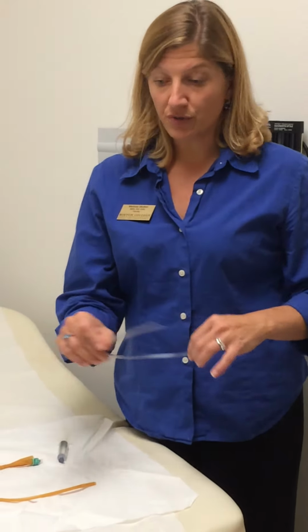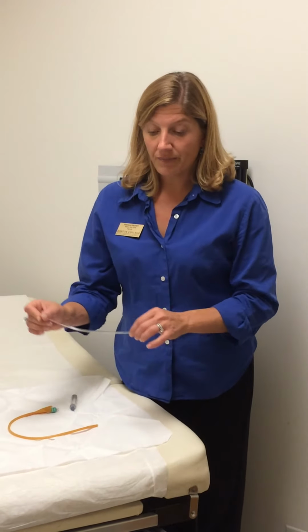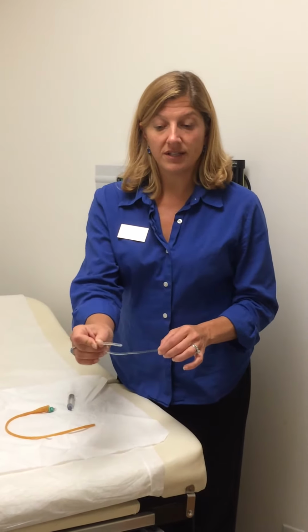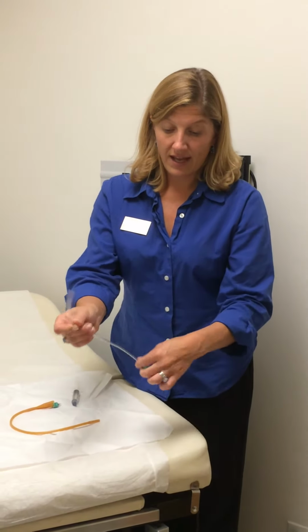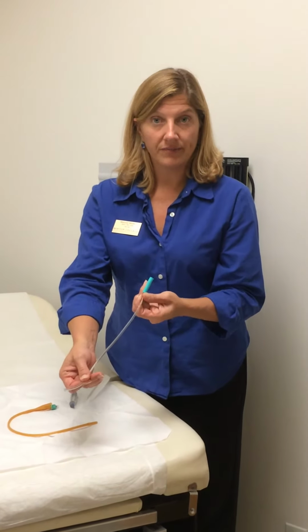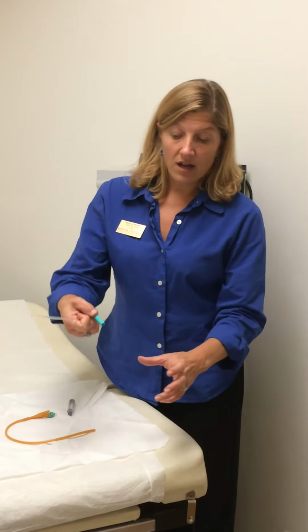What you would do is follow your normal sterile technique procedure, which you will see in a minute, lubricate the tube, and gently slide it into the urethra, into the bladder. The holes at the top of the tube will allow urine to go into the tube, and urine will come out the bottom here. You can drain this directly into a drainage bag, depending upon your facility, into a urinal, or into a specimen cup.